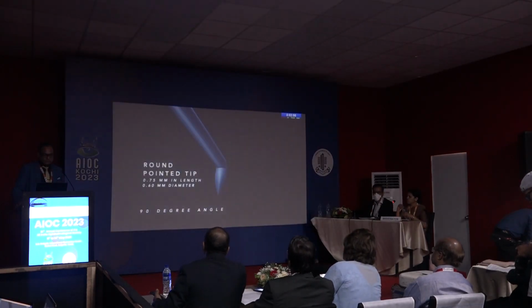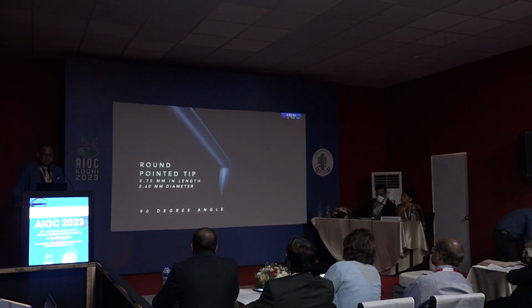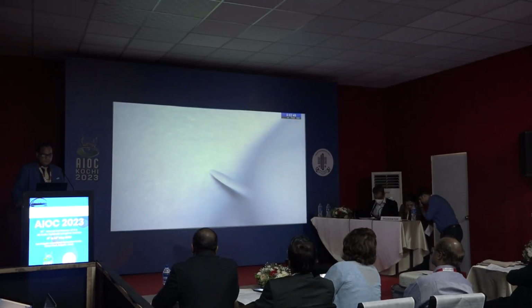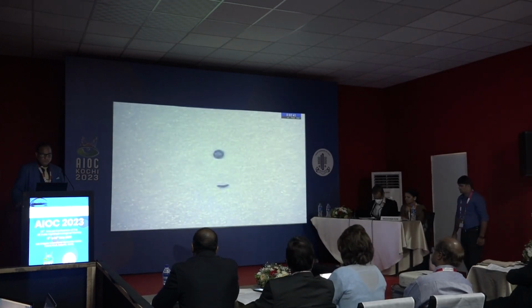So we came up with a hypothesis that if we are able to manually create an opening in the anterior capsule with a round regular configuration, like a capsulotomy with a round continuous circular edge without any discontinuity, it will not tear away with a sudden outburst of the intralenticular fluid.